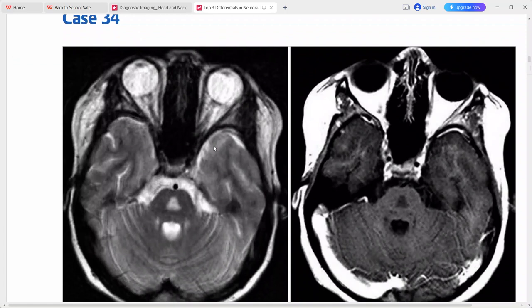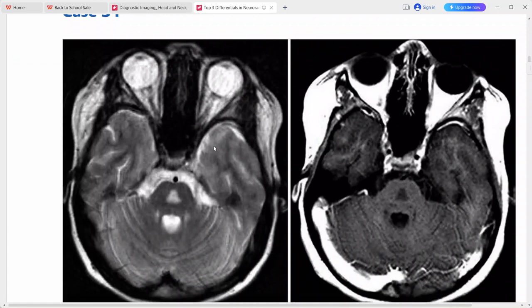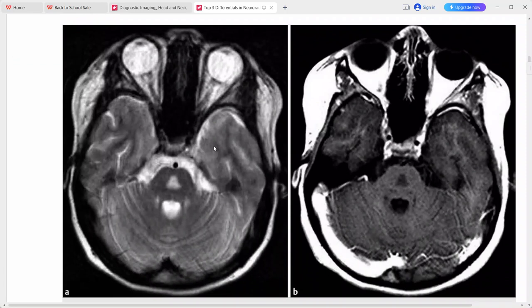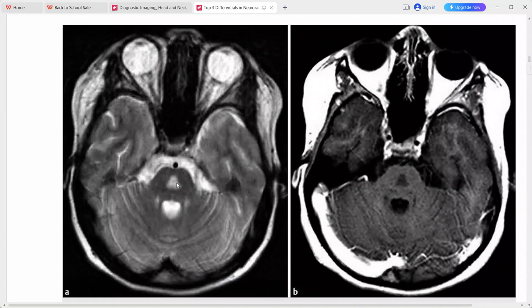This is a young adult man who presented with altered mental status. On T2-weighted MRI and post-contrast sequences, there is a triangular-shaped region of increased signal on T2 and decreased on T1 within the central pons, with no enhancement in this lesion.